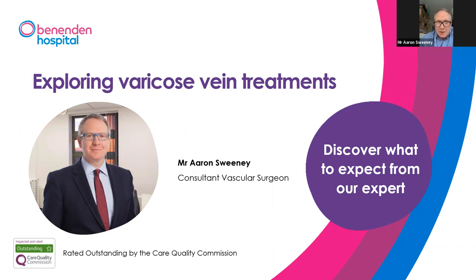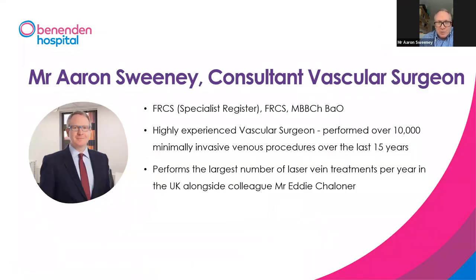It worked moderately well. And then over the next few years, we did a lot of research on this and essentially fine-tuned it, got the right settings and made it work properly. And then it was about 2005 that we rolled this out in the NHS in the first instance and started offering laser treatment for veins. So laser treatment for varicose veins is not the same as some James Bond movie where we zap people from outside. It's actually threading little small lasers, which are rather like little wires, up the inside of a vein. We damage that vein from the inside and the vein shrivels up and disappears.